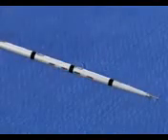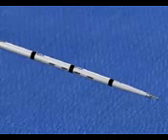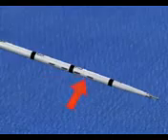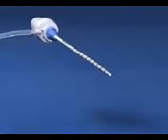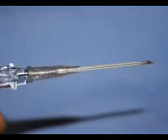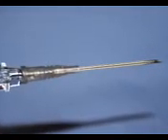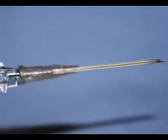Additional advantages of paracentesis-specific devices include multiple distal drainage holes which facilitate rapid fluid removal, and a pigtail mechanism that curves the distal end of the catheter away from intra-abdominal structures during advancement. If such devices are not available at your institution, standard 18-gauge intravenous catheters may be used. The technique described in the following section is applicable to all over-the-needle catheters.